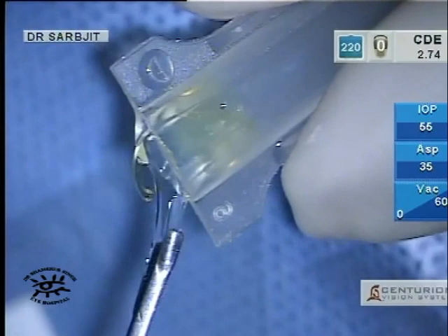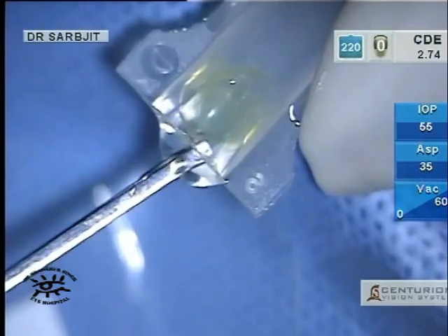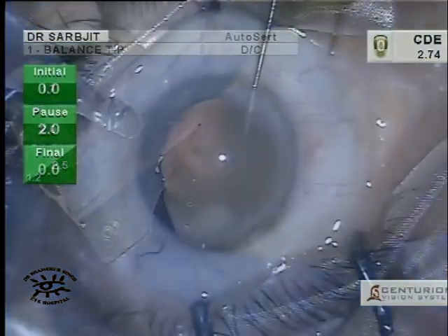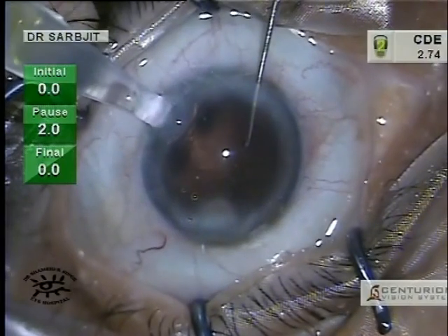An Acrysof soft IQ lens is folded into a D-cartridge, and I use an autocert which I think has made insertion of the IOL quite smooth.